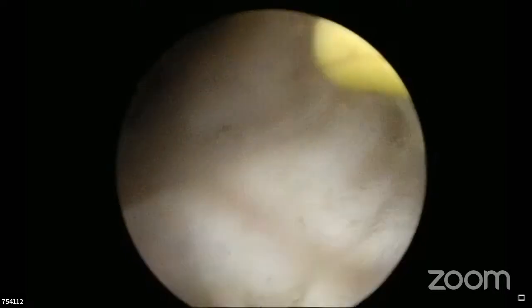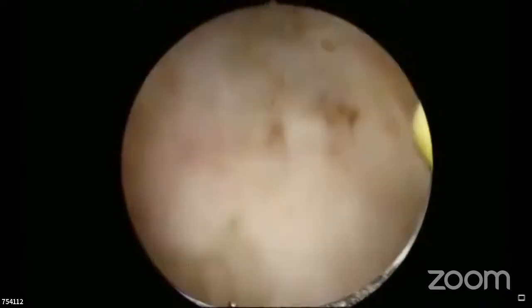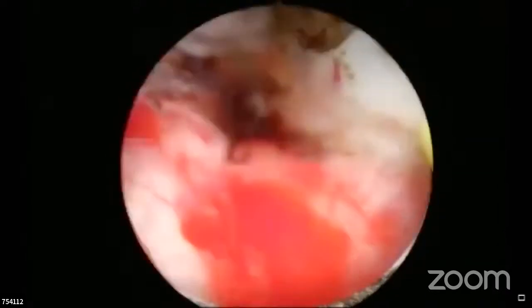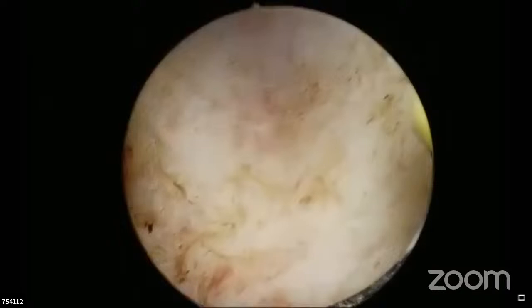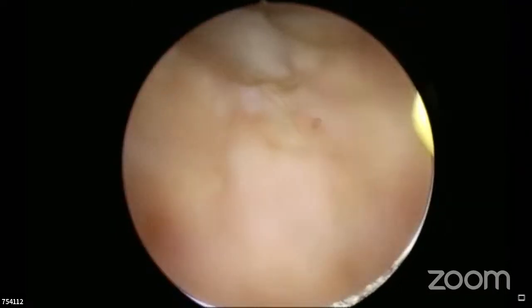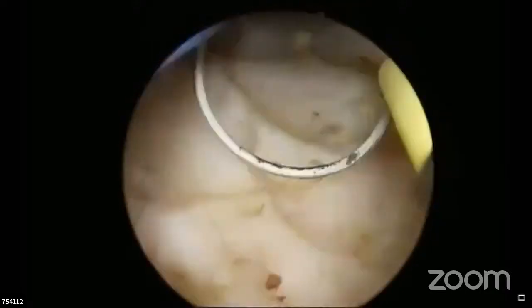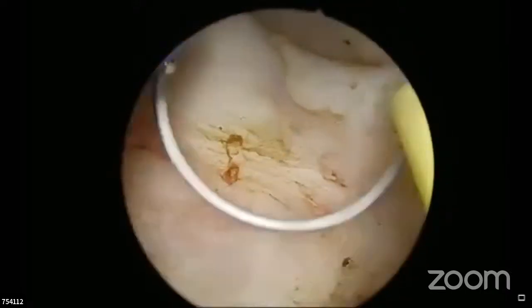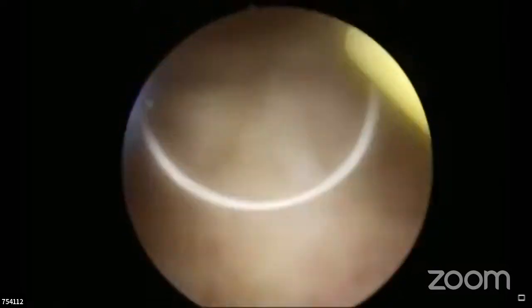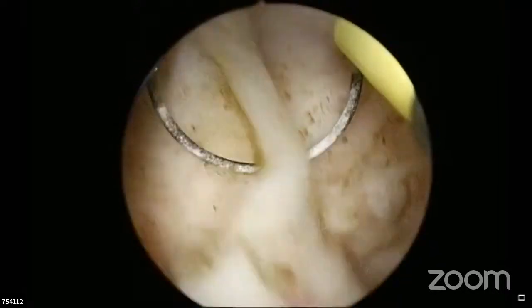I think so. With good instruments, with a good endo vision camera, one can do a wonderful job. And according to me, this is the gold standard for the management of the benign enlargement of the prostate in man, and is going to stay. I recommend that all the postgraduates must learn this procedure over and above whatever other things they want to learn, but they must learn the TURP before they leave their institution. They should request their teachers to teach them a good TURP. Thank you very much.